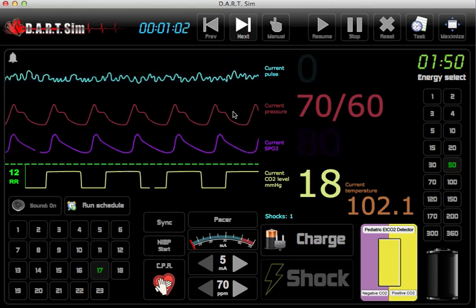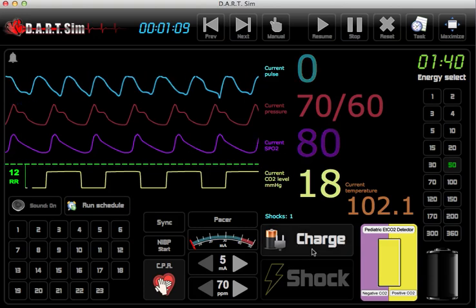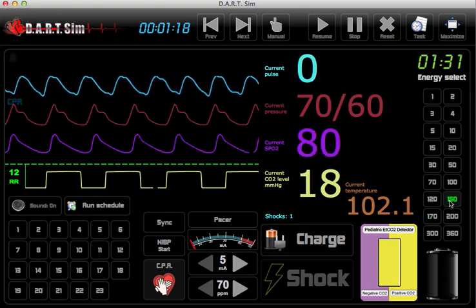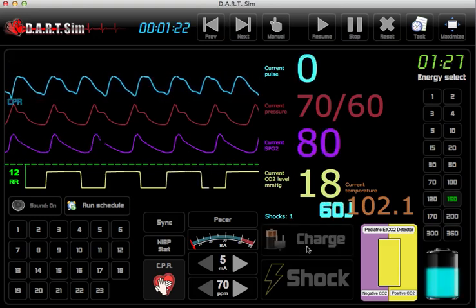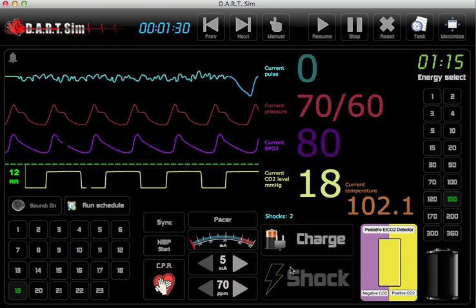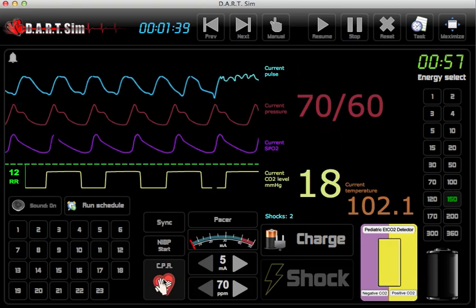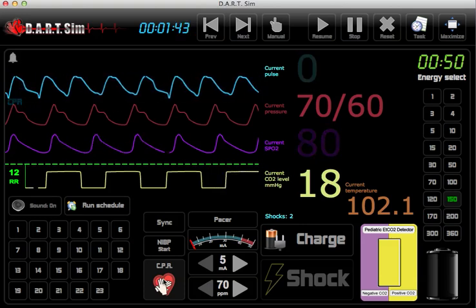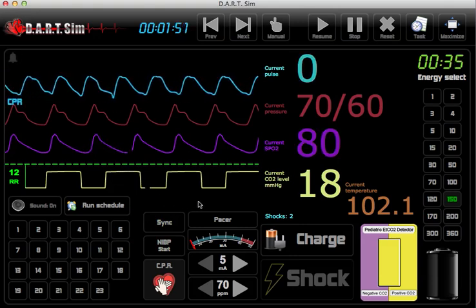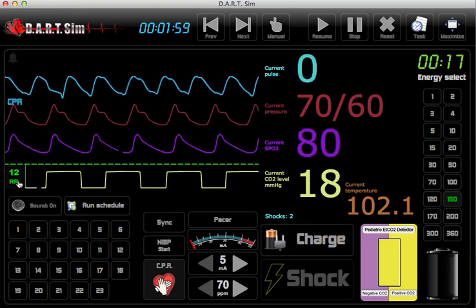The patient is now in V-fib. We'll start CPR — we've given one shock — and we charge at 150 joules and resume compressions. The compression waveform is at a rate of 100 compressions per minute. We have our waveform capnography, and we are at 18 millimeters of mercury, and we are bagging at a rate of 12 breaths per minute.